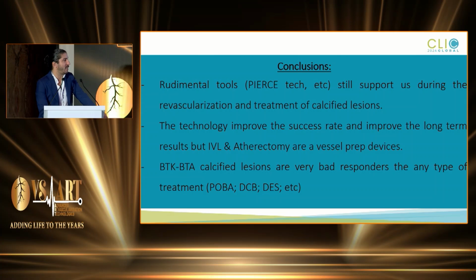So BTK, BTA calcified lesions are very bad responders to any type of treatment, POBA, DCB, DES, etc. It's for sure a big need to prepare the vessel in the proper way to obtain a good or acceptable result.